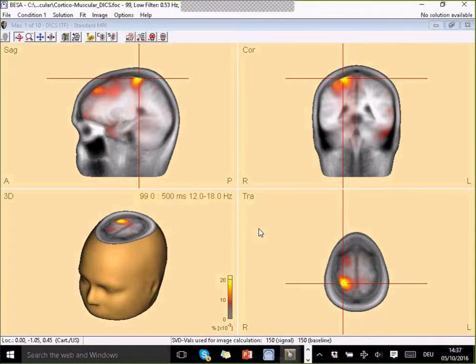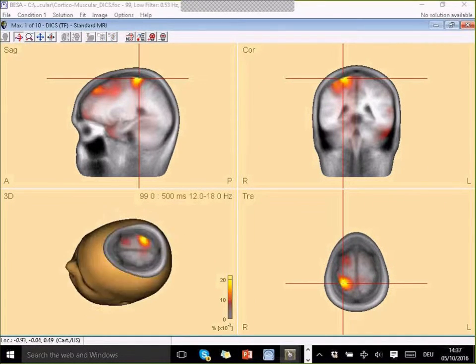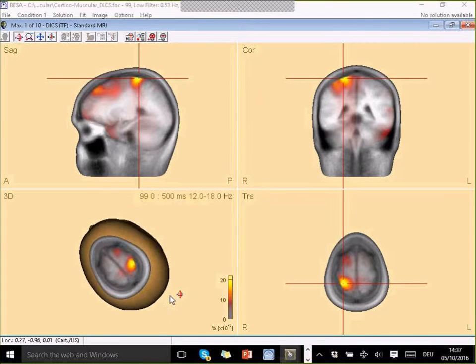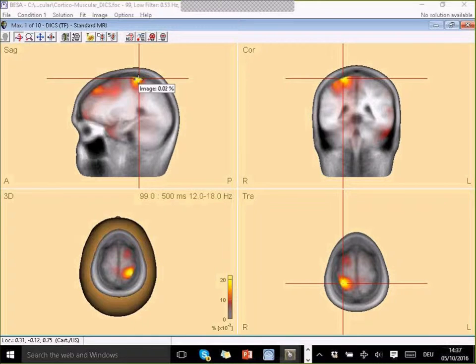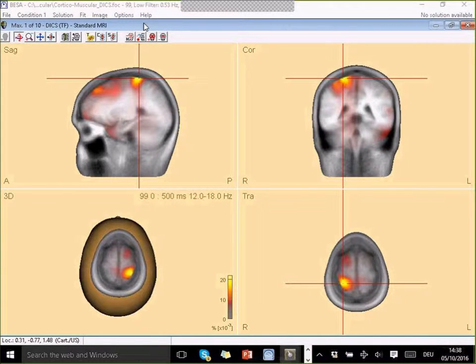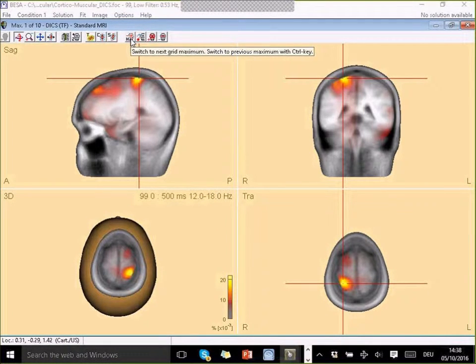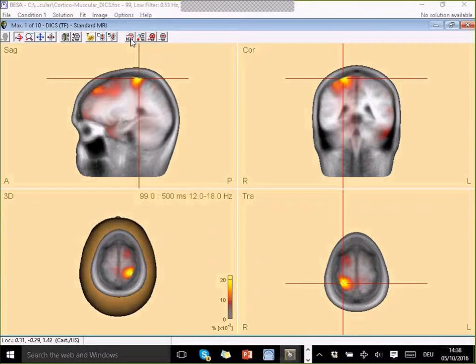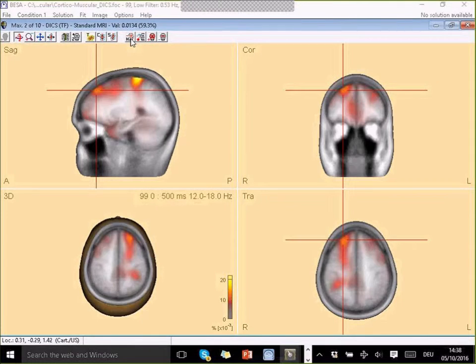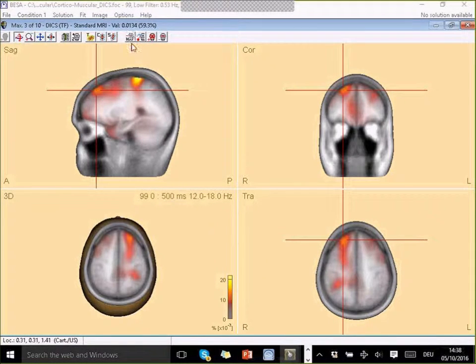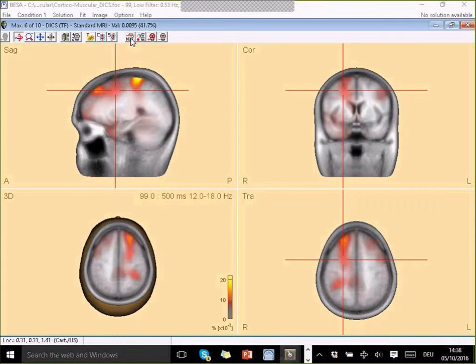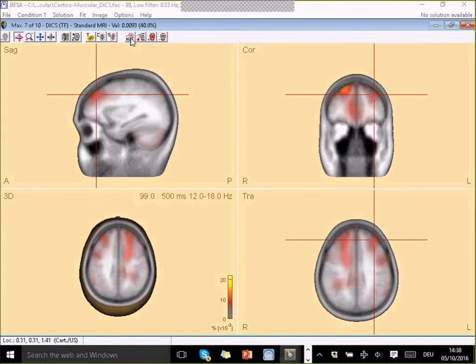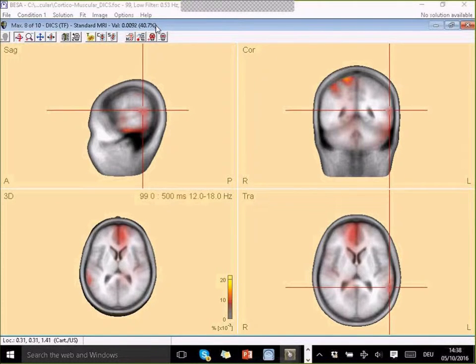And yeah, I get indeed sort of a very focal maximum in the right hemisphere in the somatomotor area where my movement in the left arm is coherent with this brain activity at between 12 and 18 hertz. We didn't put any assumptions in that. We just used the raw data and we got a completely automated analysis that showed us this result. We get a few more activation centers that could also be of interest. And so that's also a nice alternative to the source coherence using this type of coherence estimator.